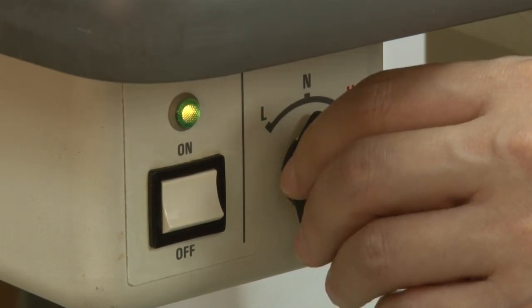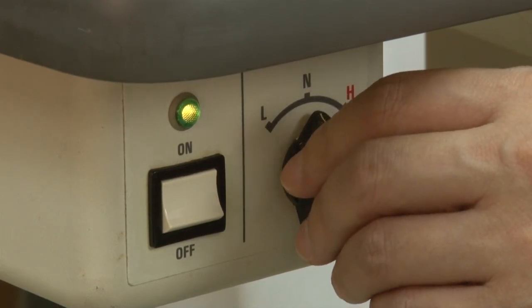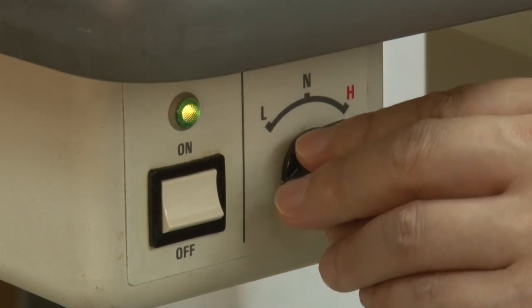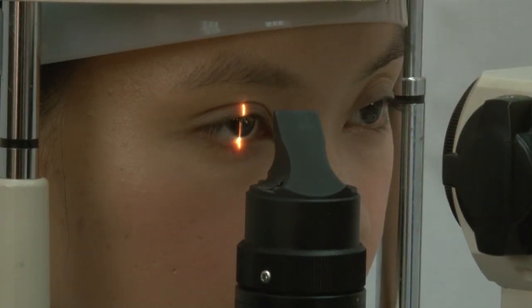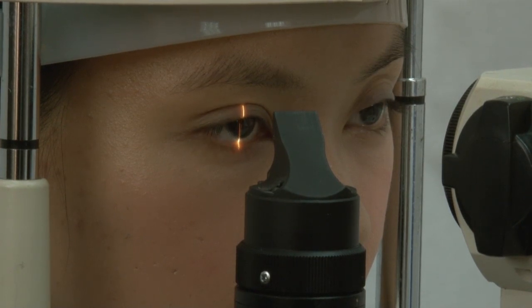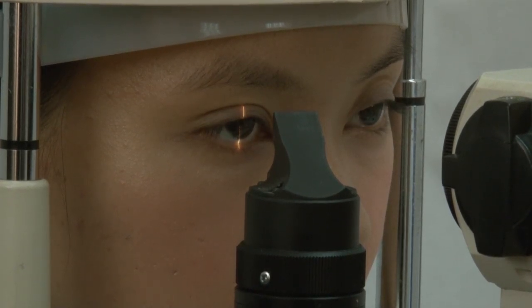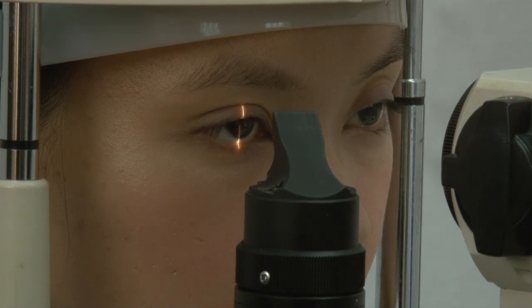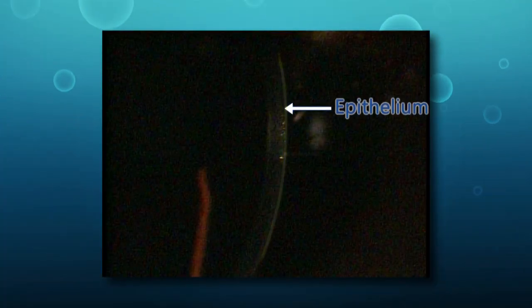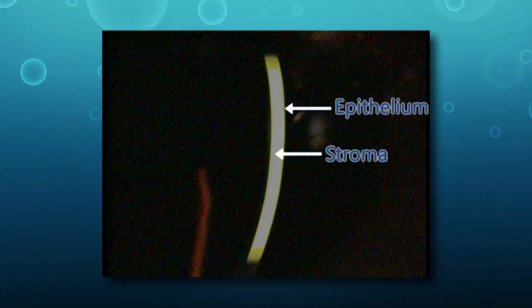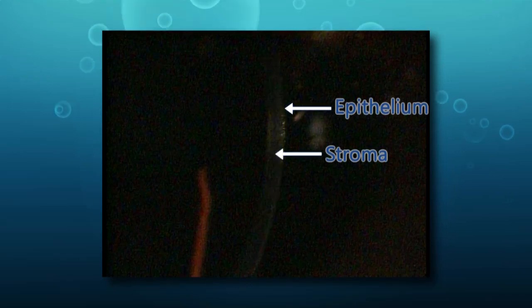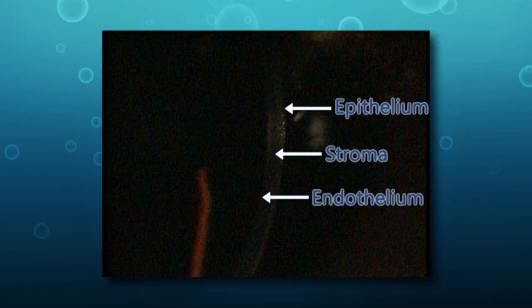Gradually increase the light source from low to medium to high. This illumination is generally used to view a cross-section of the cornea. An optic section helps to differentiate the various layers of the cornea, including the epithelium, the stroma, and the endothelium.